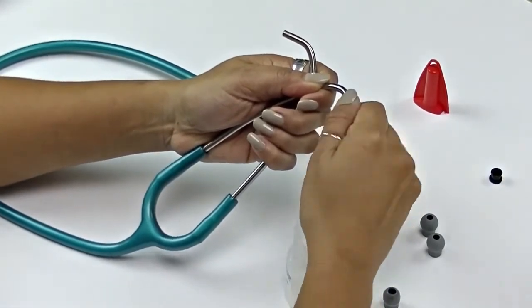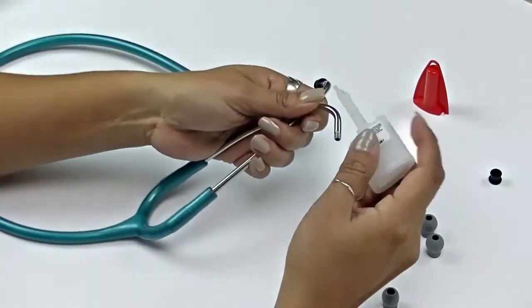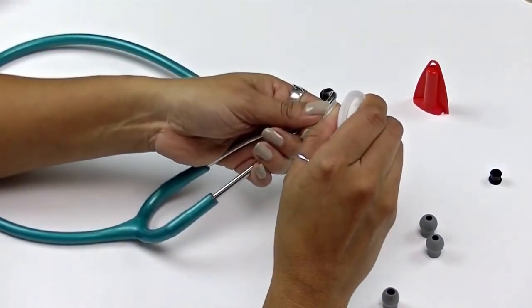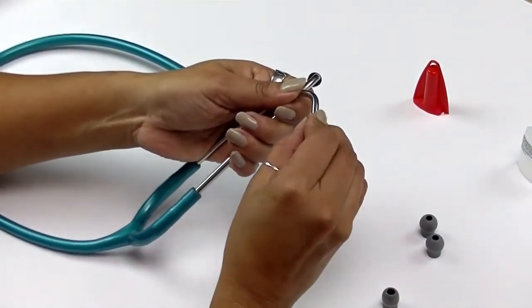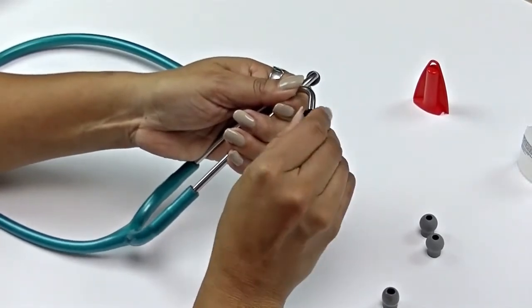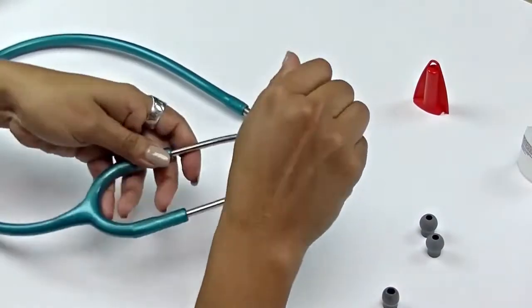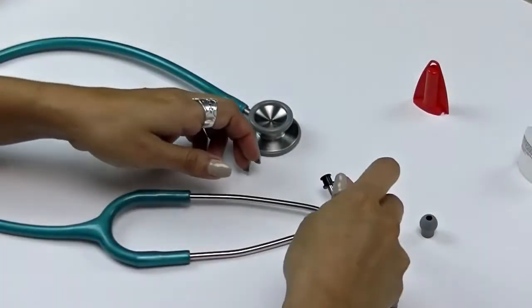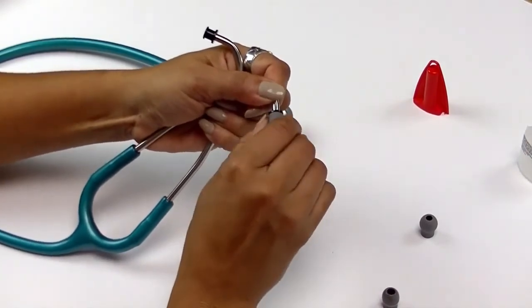If there is any visible excess glue, wipe it off with a cloth. Once the glue has dried, simply snap the new AdSoft Plus ear tips in place over the adapter.